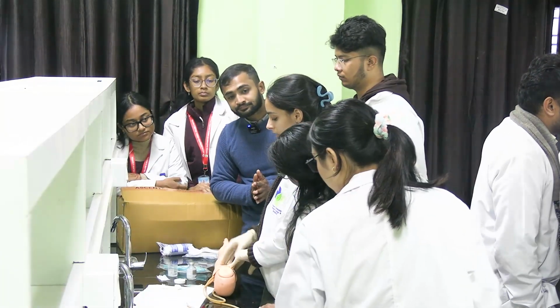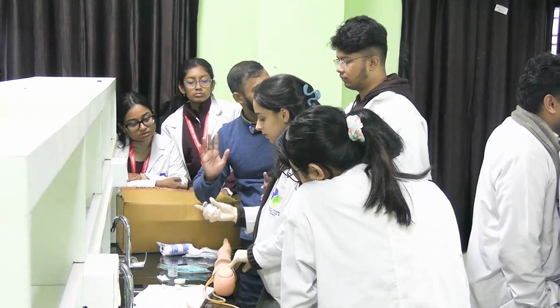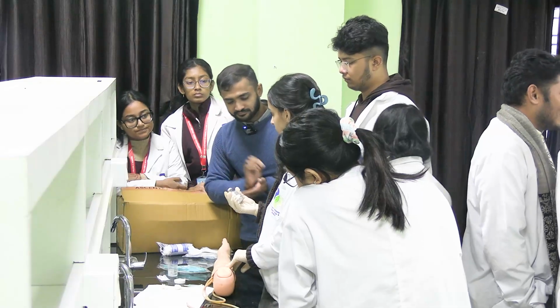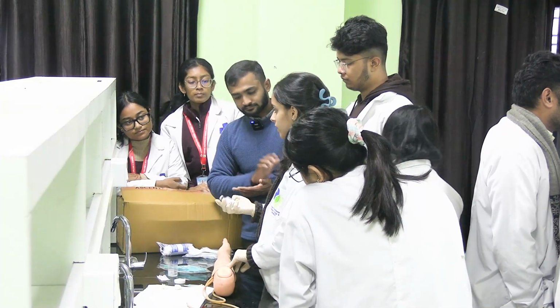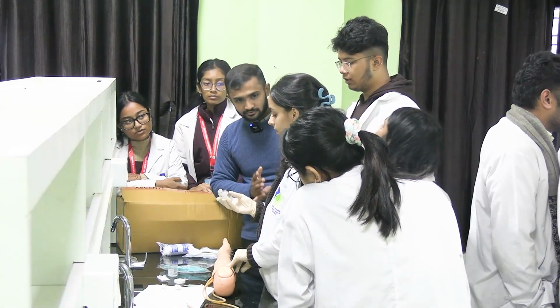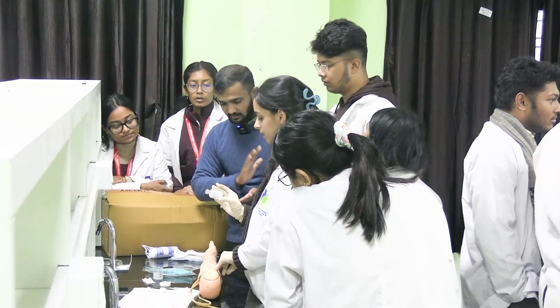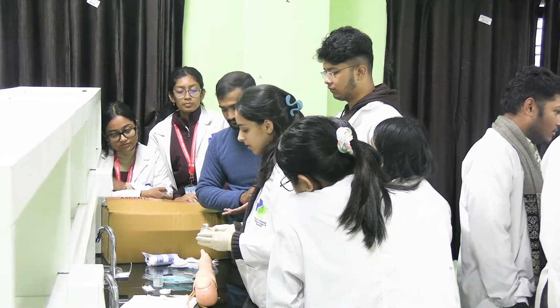Then we'll take the vial. Suppose now you'll be taking from the vial. That time you had taken from the ampule. You know the technique for taking from the ampule solution. Now how will you be taking from the vial? So first we'll check the labels: drug name, dose, manufacturing, expiry, and the color. Okay, then if it is fine, we'll proceed.